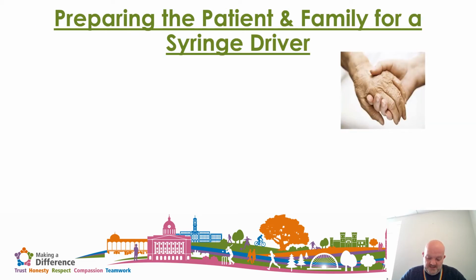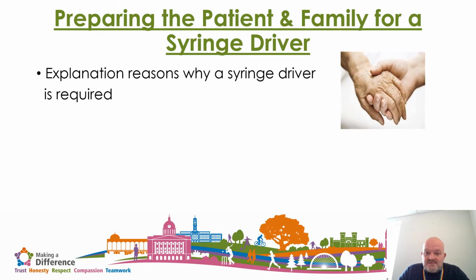So when we look at a patient starting a syringe driver, one of the things that's really important is to obviously get some sort of verbal consent. In order to do that, we have to provide that patient and their family with as much information as possible. Some of the areas that they may have questions about are, obviously, they do need to know why a syringe driver is required.